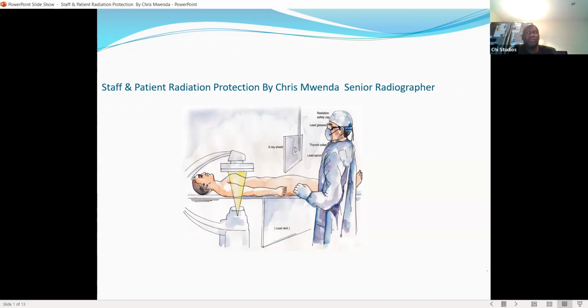In this segment of my presentation, I just looked at the basic things we work on in radiation protection in the Cath Lab. Radiation protection is everyone's responsibility. I know the radiographers are the backbone of it, and they are the driving force of that. Okay?